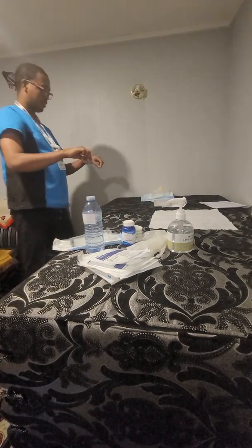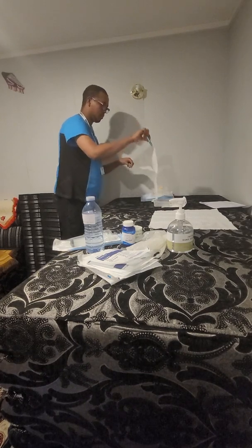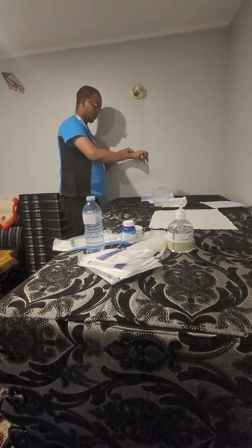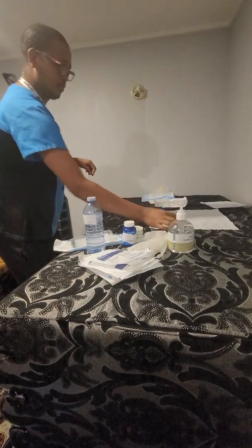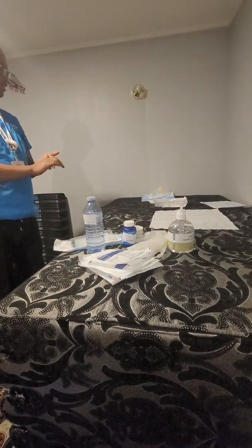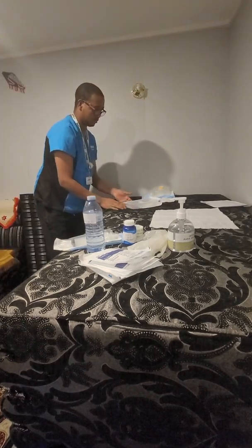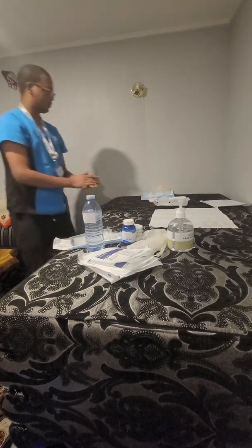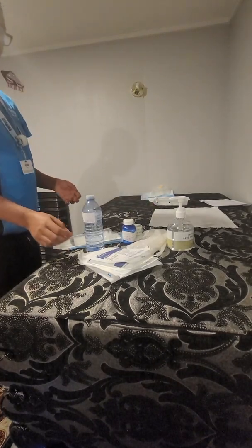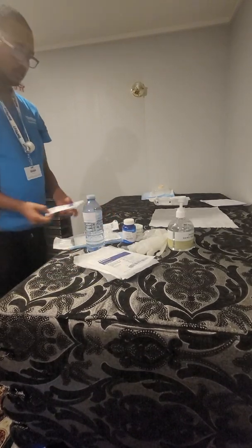Okay, I'm gonna put this one to catch some water, then put it here, and then I'll just rotate this one. And then introduce my abdominal pad and 4x4.